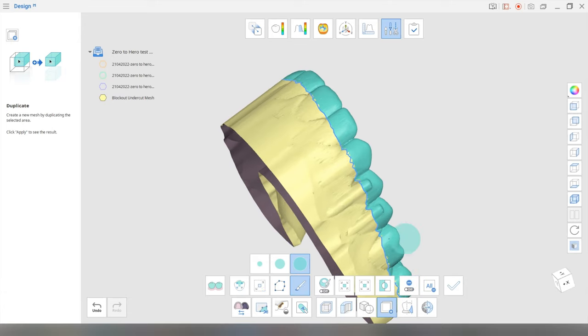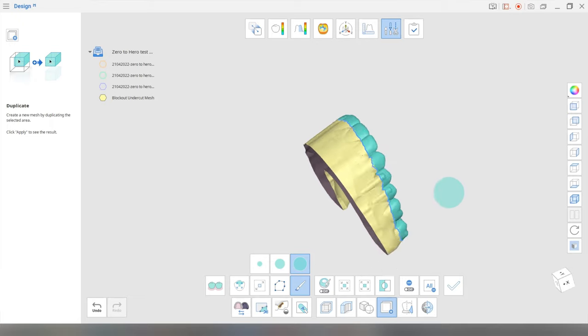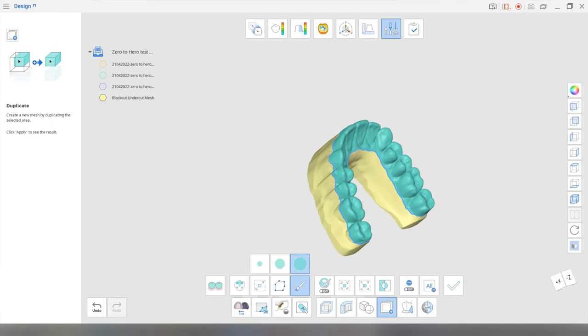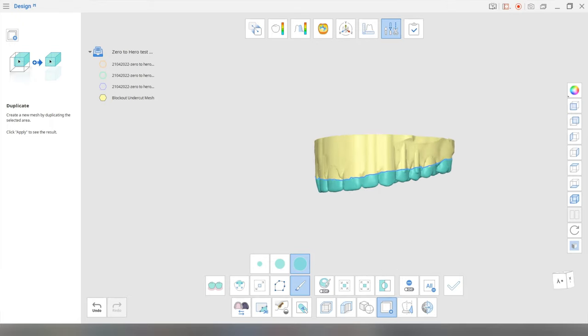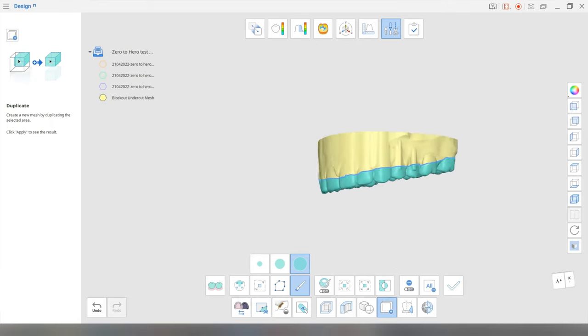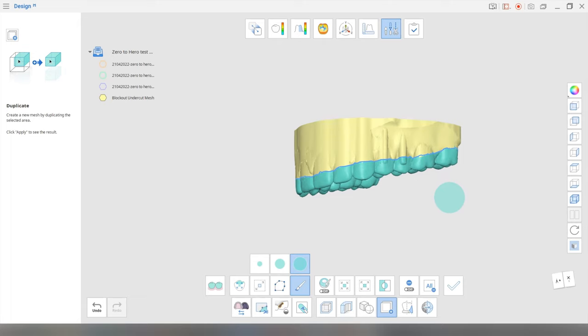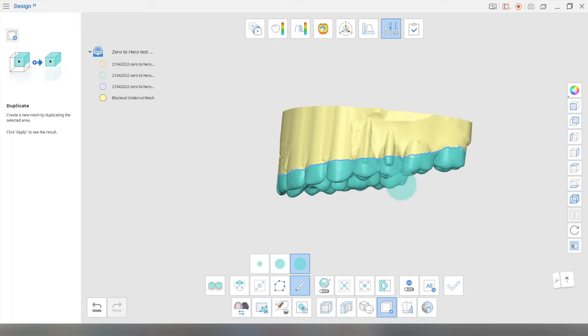I'm going to just trim those parts away. And that is looking pretty good in my opinion. Once again, just going to make sure that there's no holes in your mesh. But yeah, that's pretty much what I want in my splint. Maybe you probably don't need that much on the sevens.